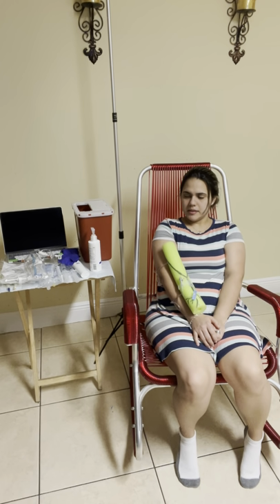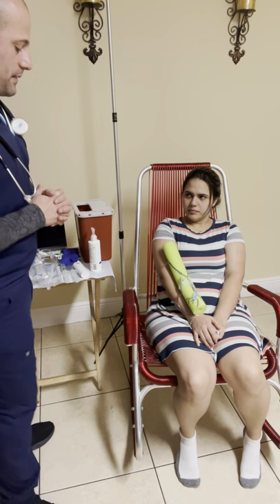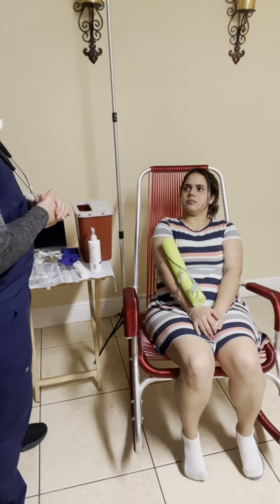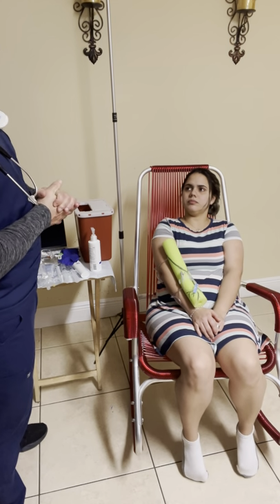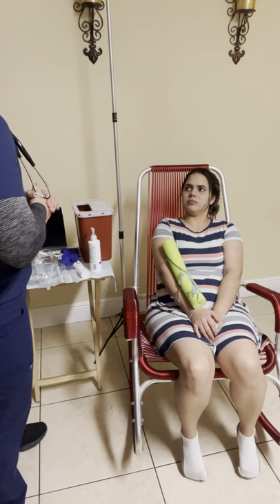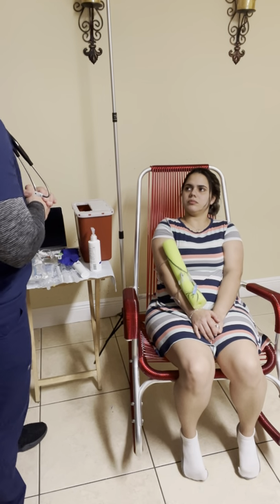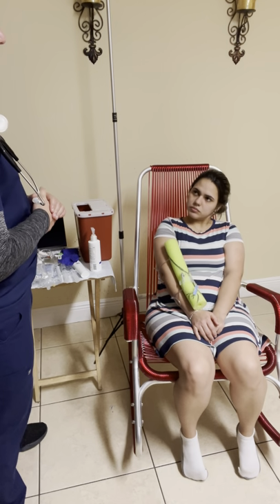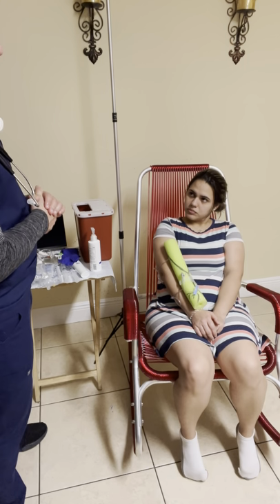May I come in? Sí, pase. Hi, my name is Alien. I'm going to be your nurse today. I reviewed your chart and your doctor ordered you an IV of sodium chloride to maintain your hydration, okay?